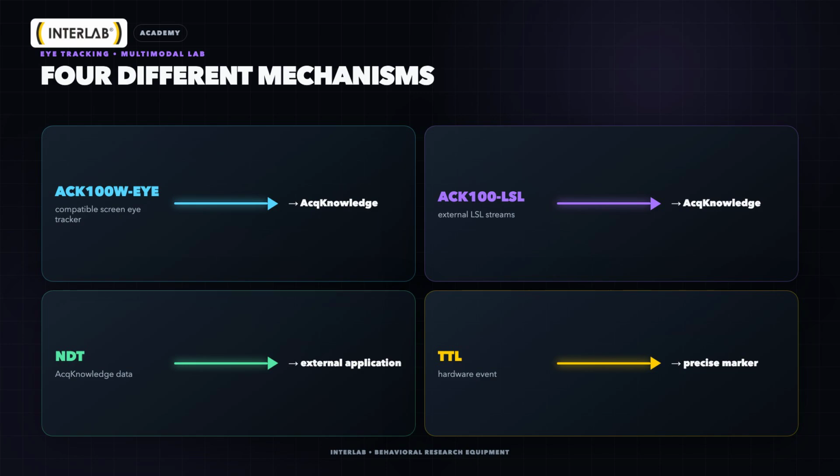The fourth mechanism is TTL. A short electrical pulse can mark stimulus onset or a participant response without relying on the usual operating system and network delays. TTL is not obsolete. In many setups, it remains a useful deterministic reference point.